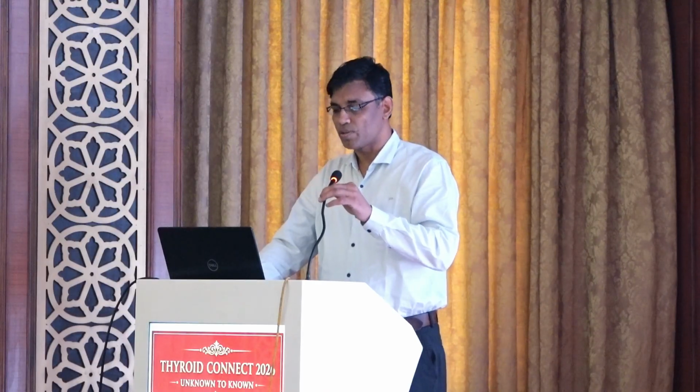Coming to the lecture part, basically we are discussing the role of ultrasound and cross-sectional imaging when we talk about thyroid cancers, and how it is relevant in today's era of guideline-based imaging. So first, keeping with the anatomy, ultrasound is the first and foremost modality. It is used for thyroid nodule evaluation, for risk stratification, for the evaluation of the nodes in the cervical region, and it acts as a guidance modality for doing tissue sampling.